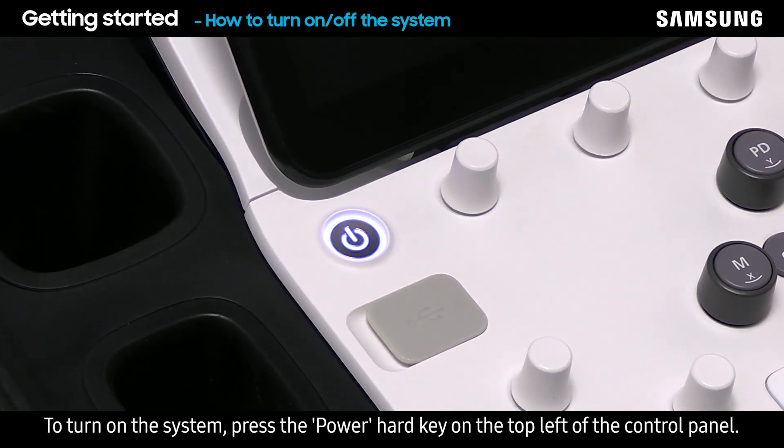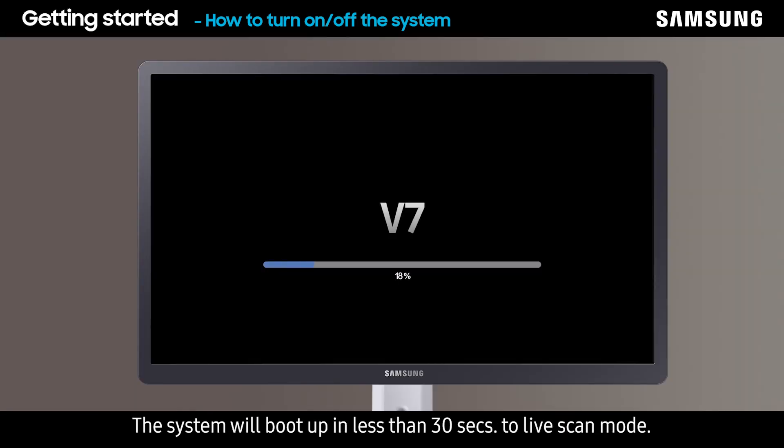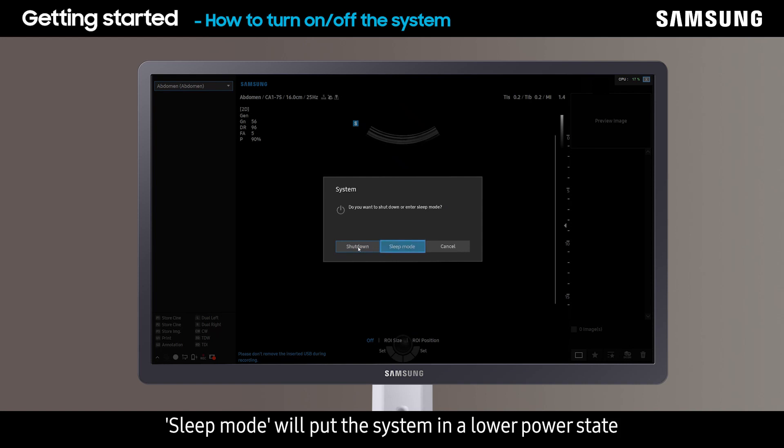To turn on the system, press the power hard key on the top left of the control panel. The system will boot up in less than 30 seconds to live scan mode. To turn off the system, press the power hard key again. A pop-up message with options will appear. Shutdown will completely turn off the system. Sleep mode will put the system in a lower power state and allow the user to access the system without rebooting.